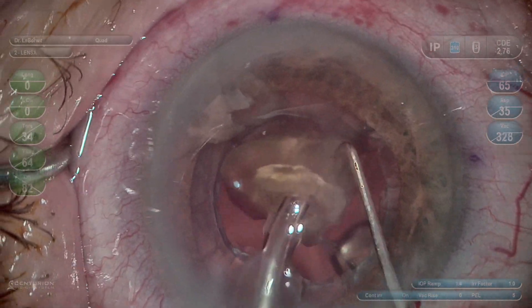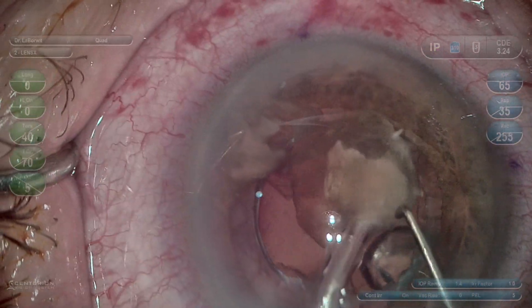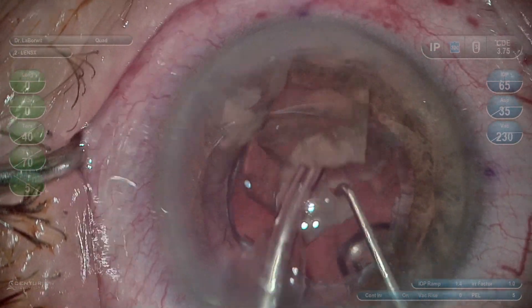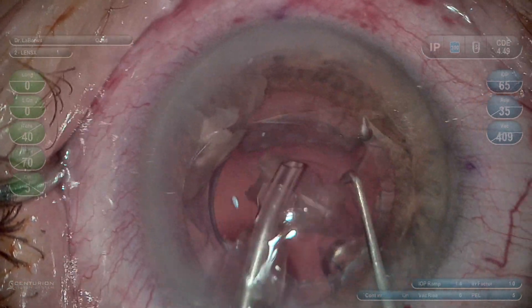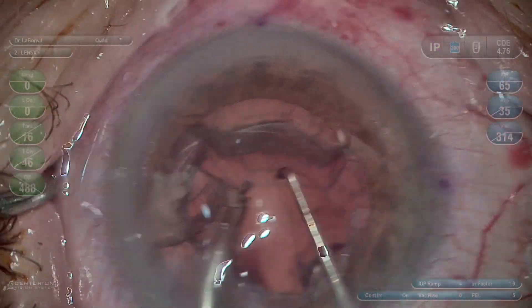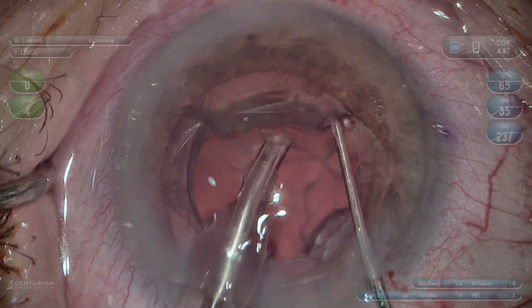You can get a better sense of the density of this lens as I try to remove it. However, the CDE is still under 5 with the density of this magnitude. Also, the phaco emulsification is deeper in the iris plane, not near the cornea.